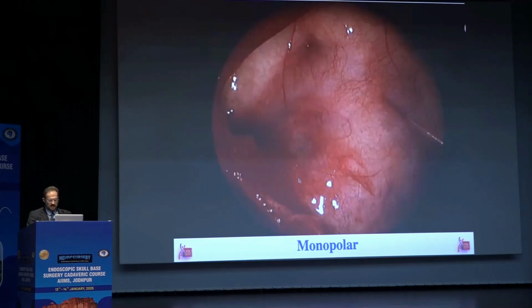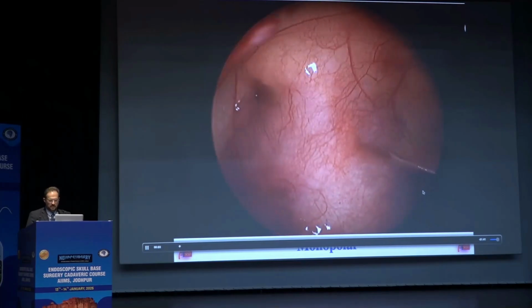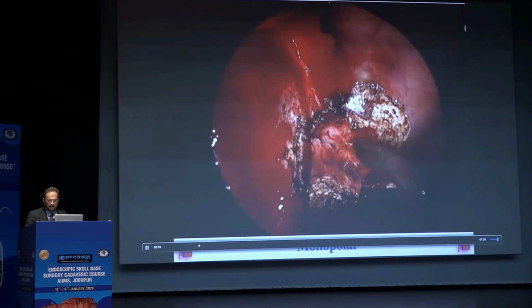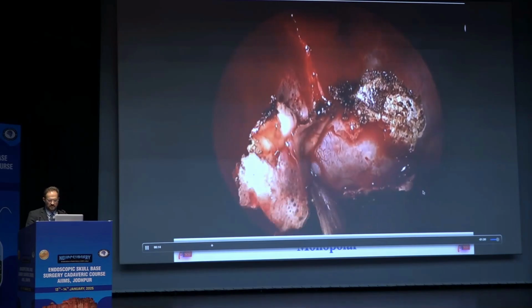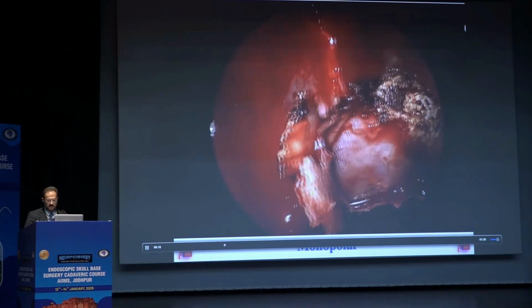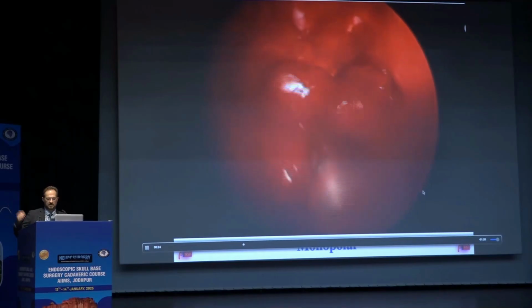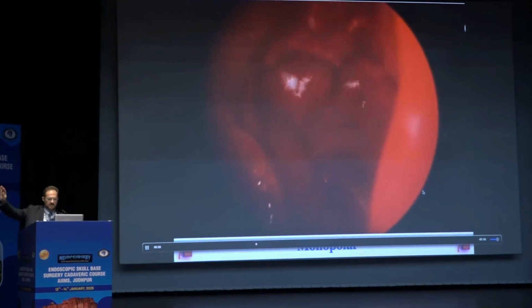And here's another one showing lack of exposure. As you can see, only one hand. This surgeon is famous, working with only one hand, didn't remove the mucosa before taking the bone, decided to use monopolar for the opening, is using only one hand to kind of crack things around, and didn't have a good exposure, and forced in the direction of the carotid. So bluntly got into the carotid artery by forcing in that direction. So never force in the direction of the carotid.